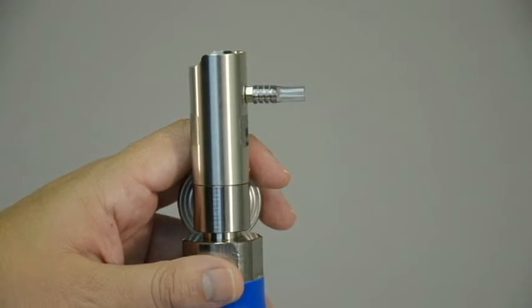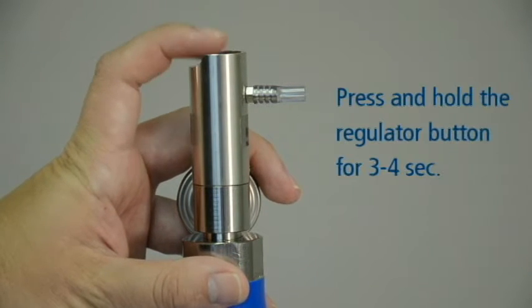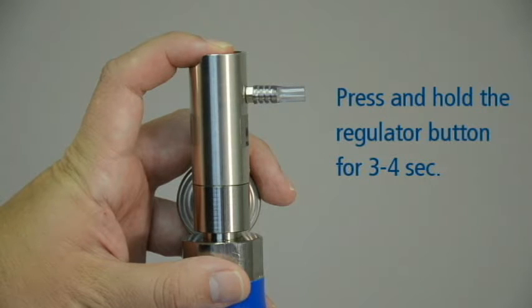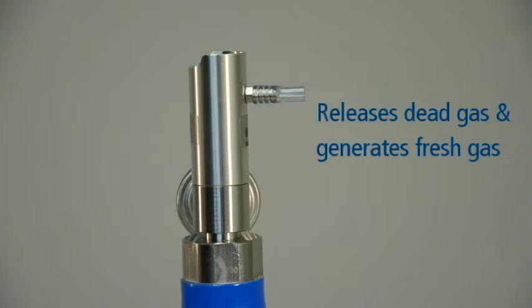Before performing the calibration, it is important to purge the regulator. This is done by pressing and holding the button or valve on the regulator for 3-4 seconds. Purging the regulator releases any dead gas that may be present in the regulator and generates fresh gas for the purpose of the calibration.